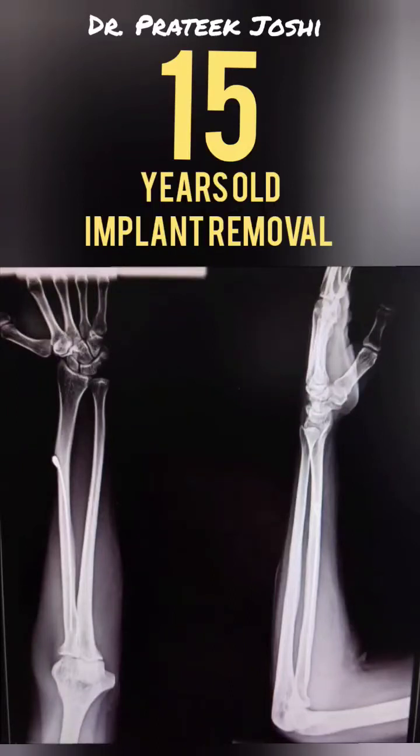Hello everyone, I am Dr. Pratik Joshi. This patient underwent surgery for left side radius fracture 15 years back. Now after 15 years, he wants to get this implant removed.